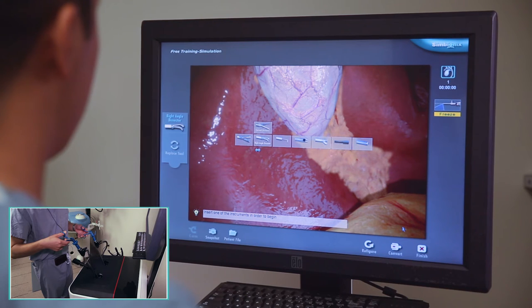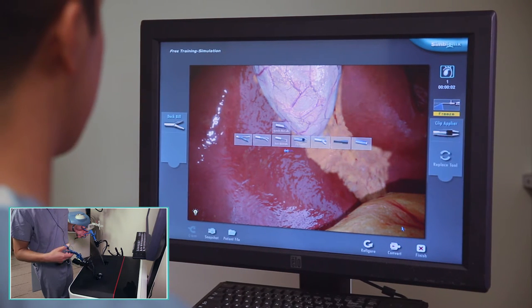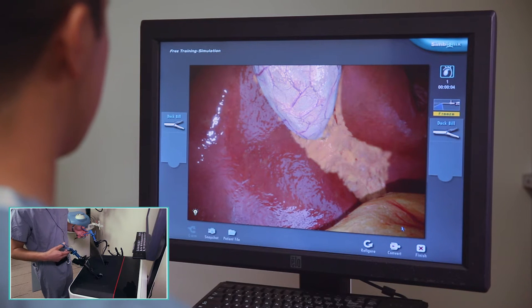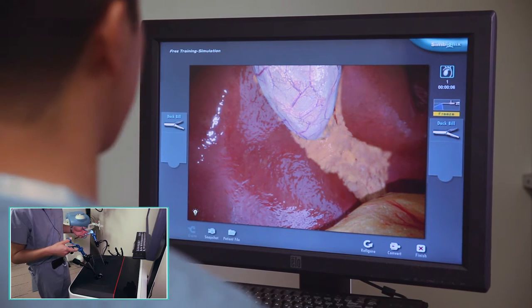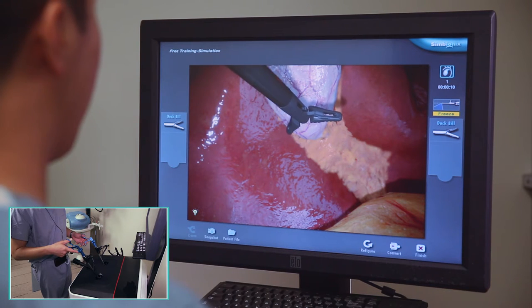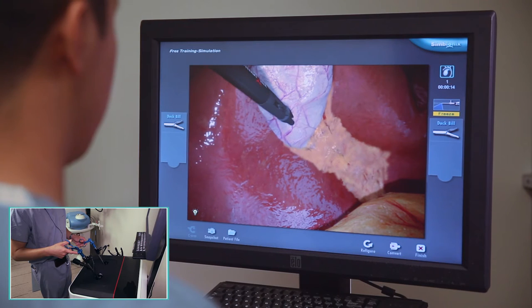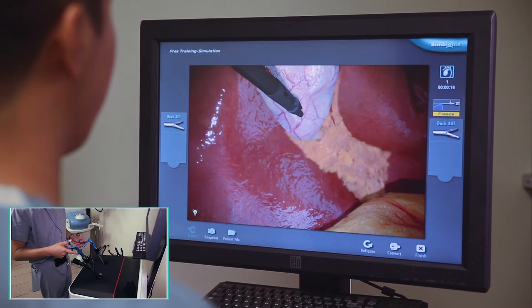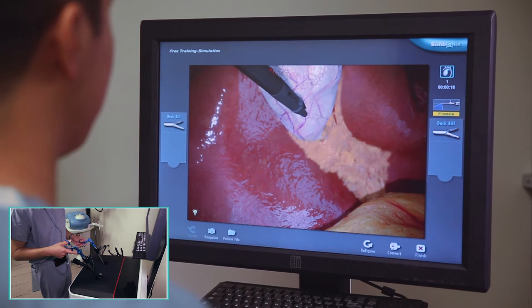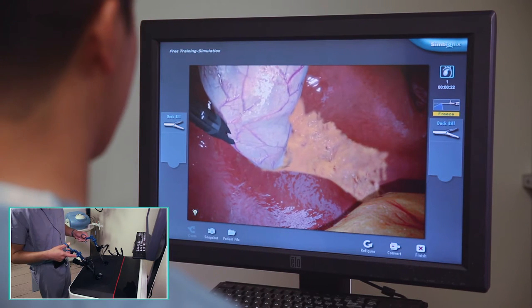I'm going to start out with two duck bills for my dissection. The reason for this is that the duck bills are both good for retraction and the least traumatic dissecting instrument that I can use. Right now I haven't really defined any of my anatomy yet, so this is the safest way to do it. I'm going to take a big bite of the gallbladder here with my duck bill. In the words of Dr. Julius Bonello, grab it like you love it.